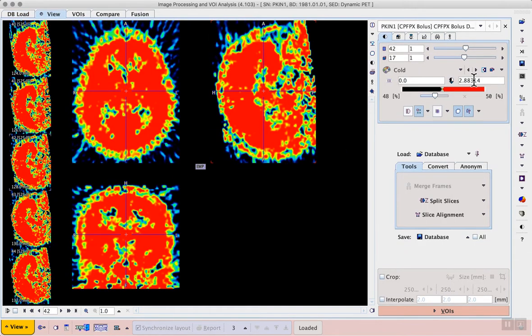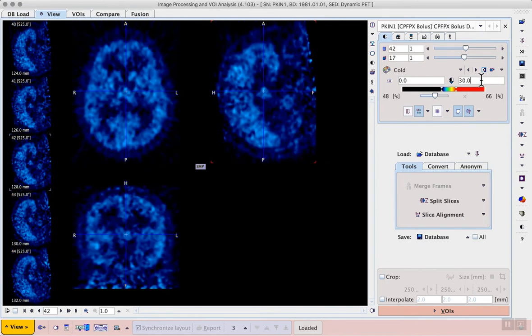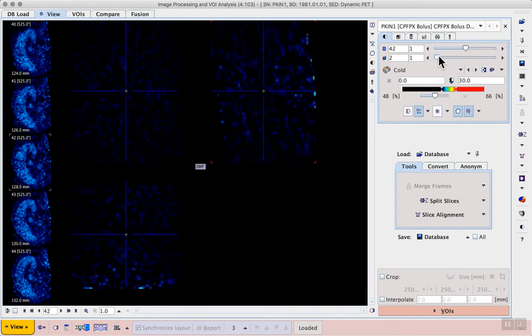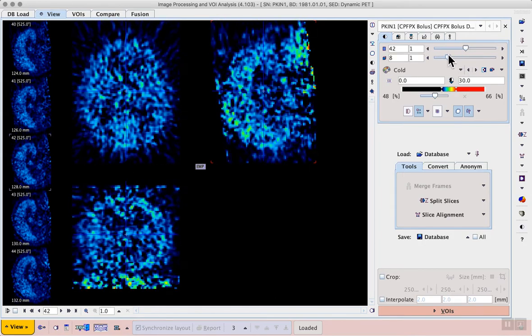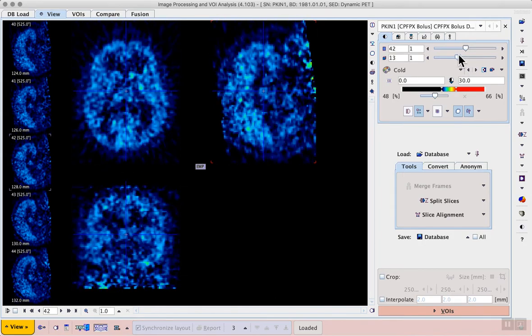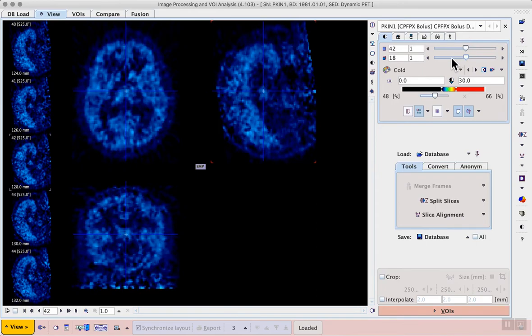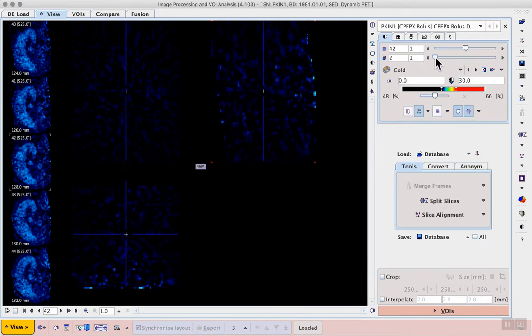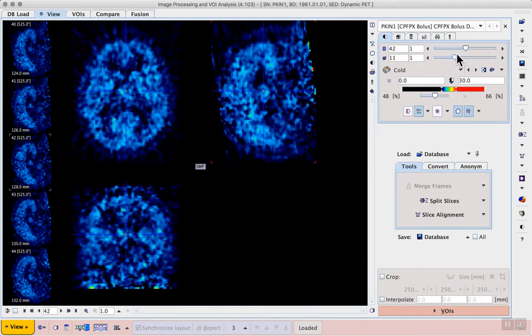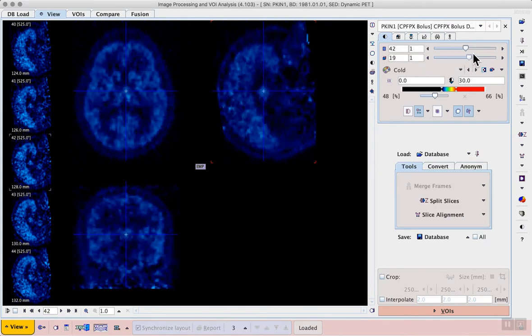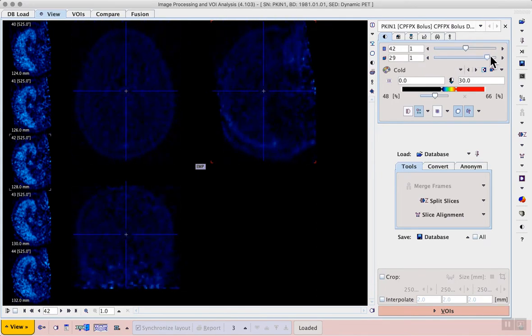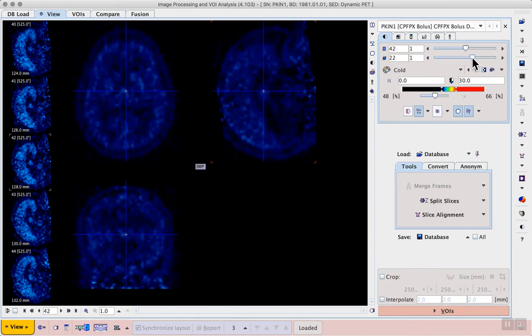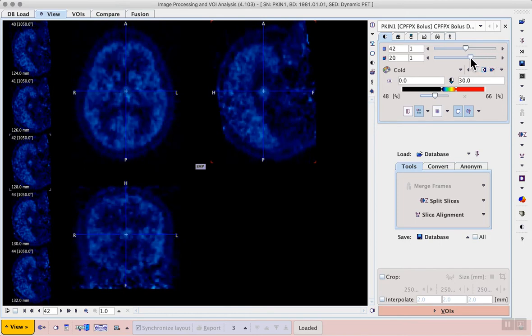First we can adjust the upper threshold - a value of 30 kBq per cc is good for this example. Then we can explore the data with the time frame slider. We see that the tracer rapidly appears in the brain and then washes out over the time of the study.